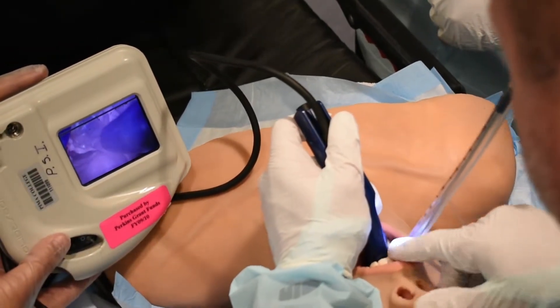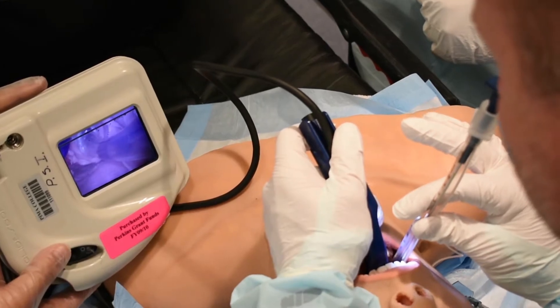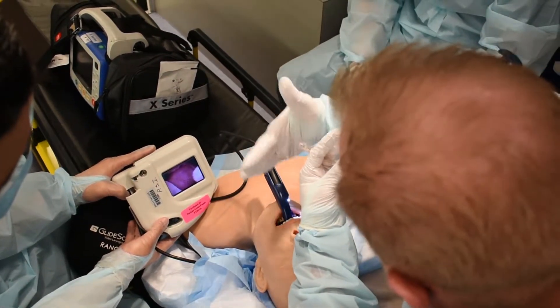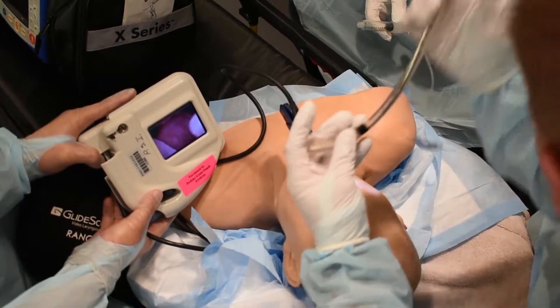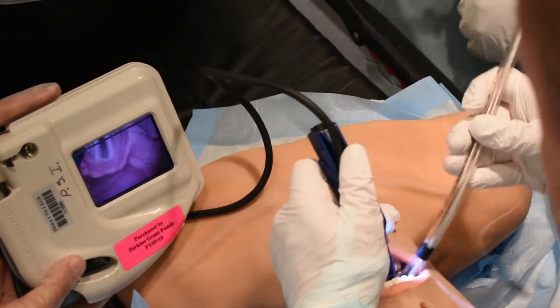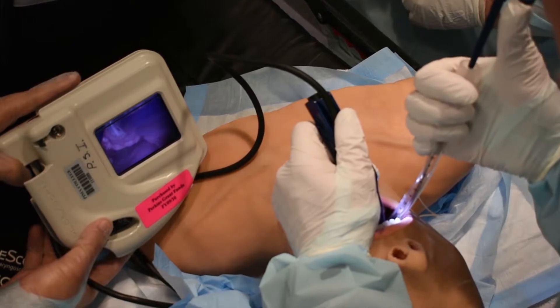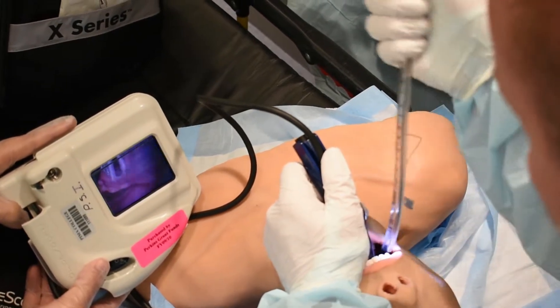Because the stylet is so rigid, the back of the tube hits against the tracheal wall and it's in there. A lot of people say they passed the tube through the cords but now it's hitting the back of the trachea and they can't advance it — and erroneously they pull the tube out. This is exactly what the rigid stylet is made for. Under video guidance, I move my fingers up and pull my stylet back, and now my tube just sinks in beautifully.